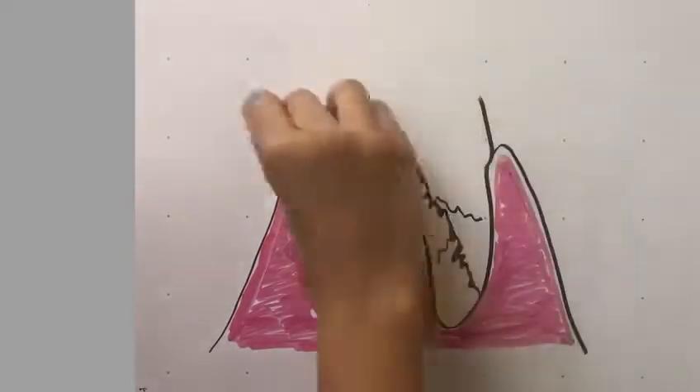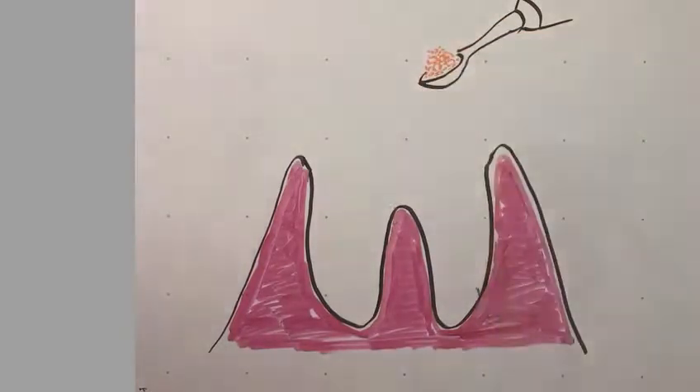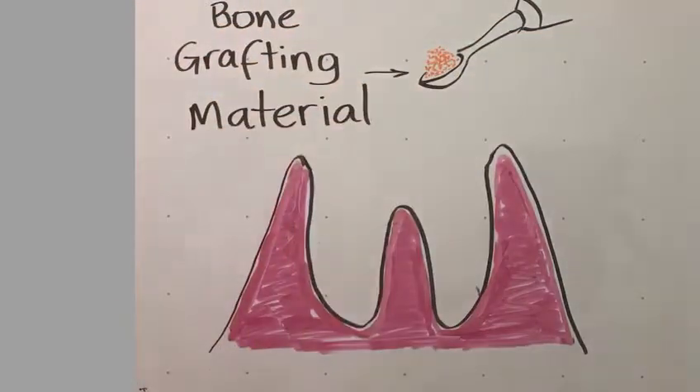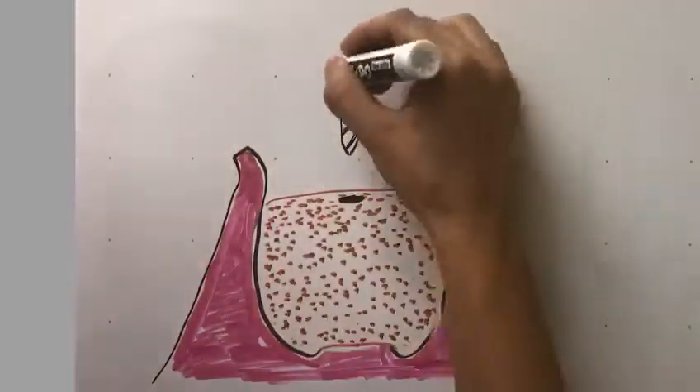A dental implant is a root-shaped post that, once implanted and integrated within the jaw bone, will serve as an anchor for a permanent tooth restoration like a crown, a bridge, or a denture.